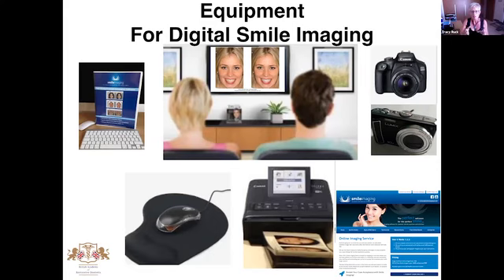As we mentioned, you want to take good quality photos, okay? So if you have an SLR, that's absolutely fine, but if not, just a point and press camera works perfectly well for the kind of quality photos we require. If you decide, once you return to work, that you want to print them out, a 6x4 printer works perfectly because it's so cost effective. It works out about 24 pence a print to print the photos out, and you can print them out like this for the patient to take away. So it's a really great marketing tool for your practice.